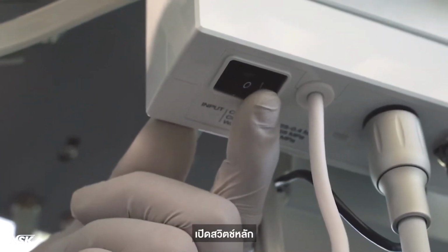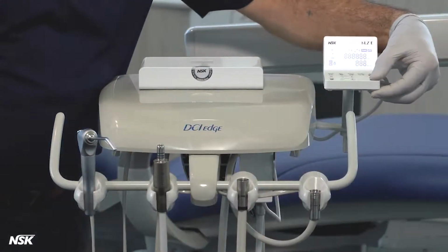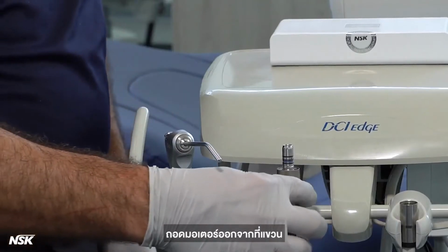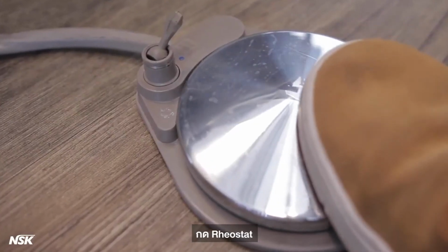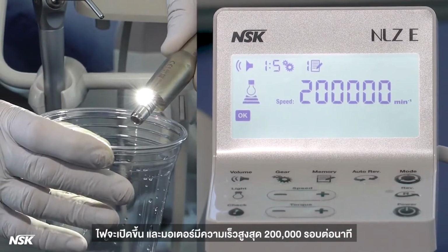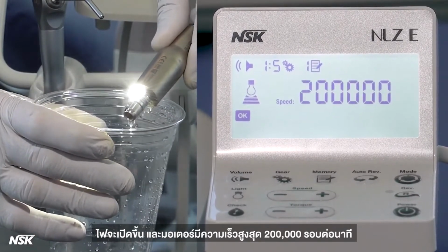Turn on the main switch. Power on the touch panel by pressing the power button. The program number 1 will show up on the screen. Remove the motor from the hanger. Press the rheostat. Wait for 10 to 15 seconds to make sure water runs through the motor, the light turns on, and the motor hits the max speed, 200,000 RPM.